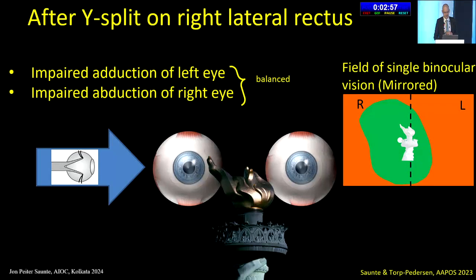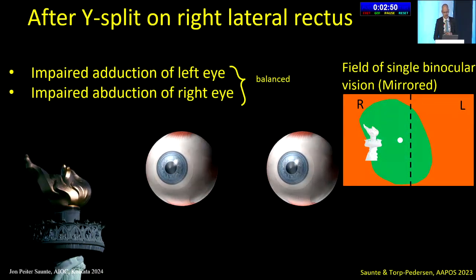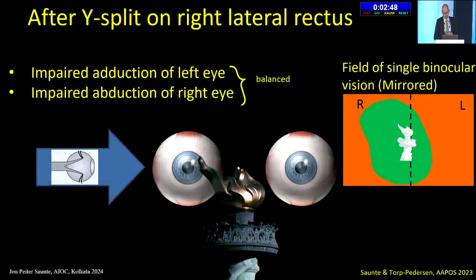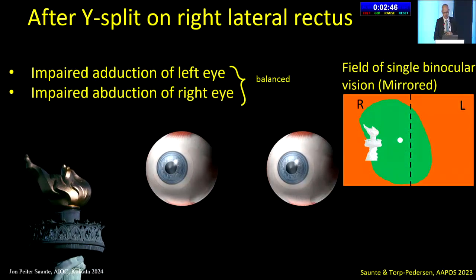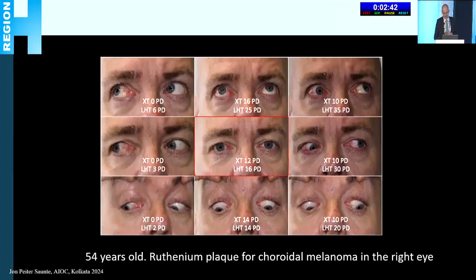Well, what we can do is to put a Y-split on the sound eye on the lateral rectus, and what happens then is that you slow the lateral rectus down, and you actually keep the adductions balanced at that side. So here's a case where we did this on a sound eye.